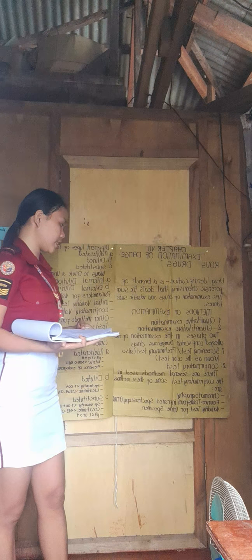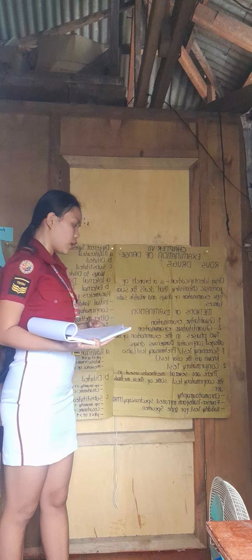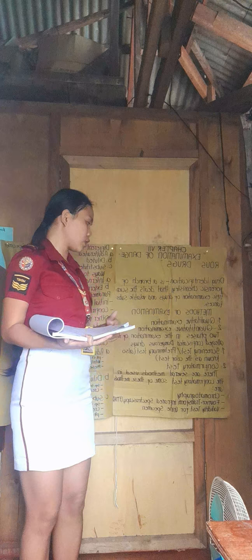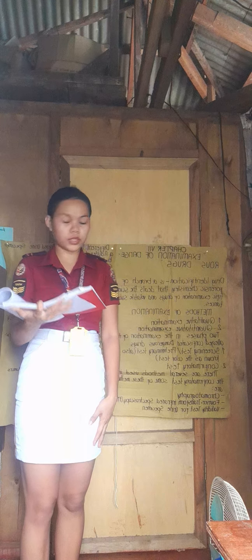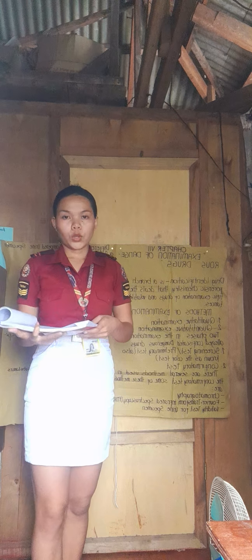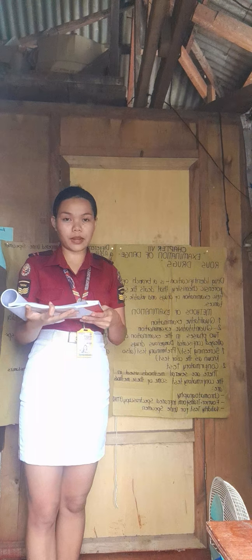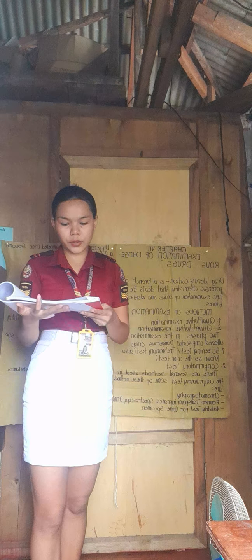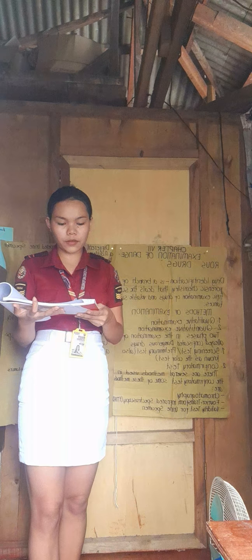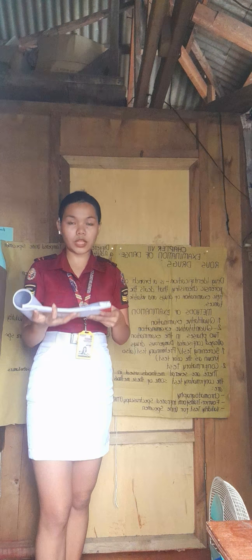So, two phases in the examination of the alleged confiscated dangerous drugs. First is the screening test or preliminary test, also known as the color test. And second is the confirmatory test. Screening test or preliminary test: this test is non-specific and preliminary in nature. It is employed to reduce the family or group of drugs to a small and manageable number.